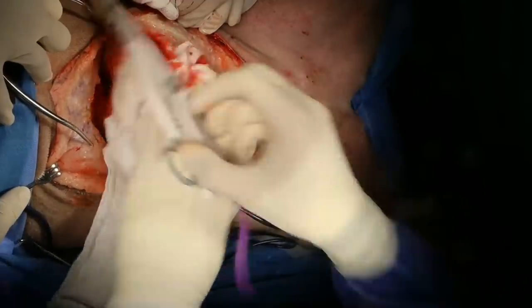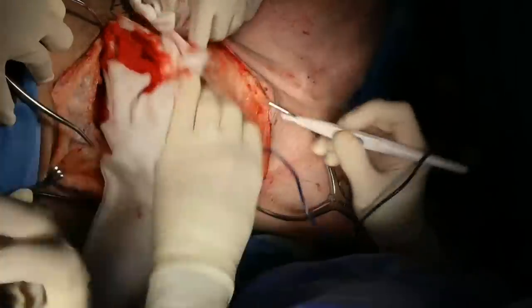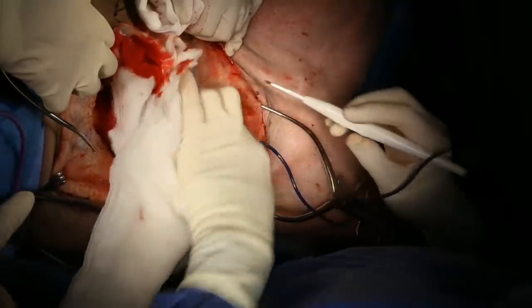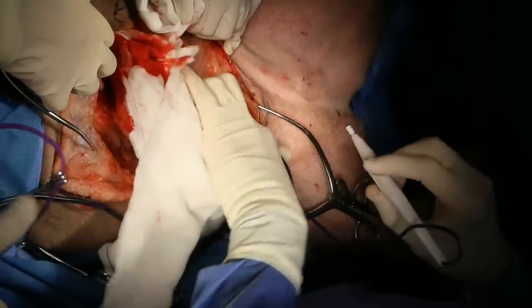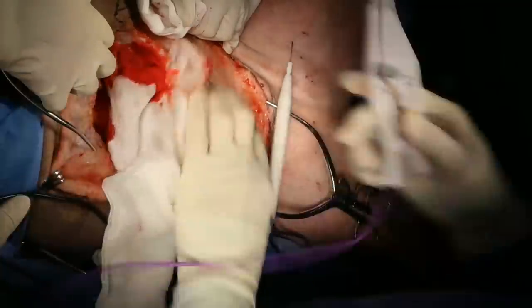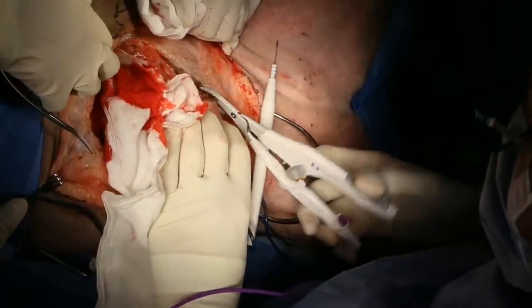Need to pop into the abdomen here and start working my way around. Okay. I think I'm down to peritoneum there anyway.